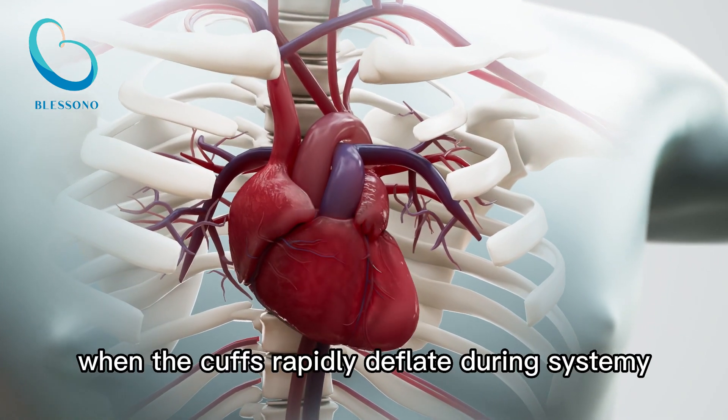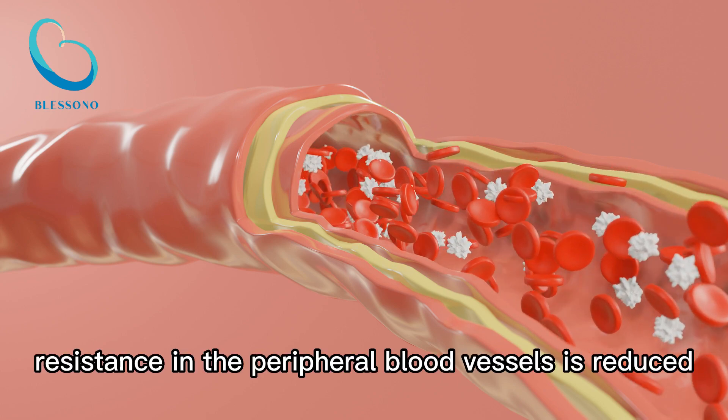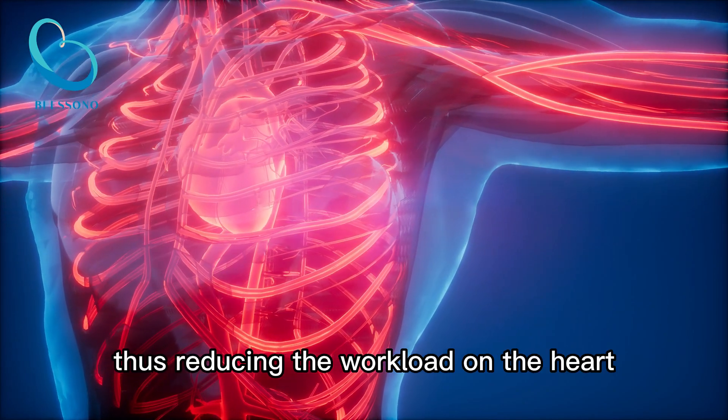Reduced workload on the heart. When the cuffs rapidly deflate during systole — when the heart is contracting — resistance in the peripheral blood vessels is reduced. This makes it easier for the heart to pump blood out to the rest of the body, thus reducing the workload on the heart.